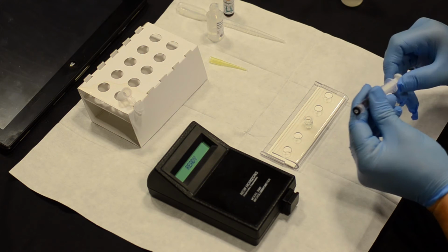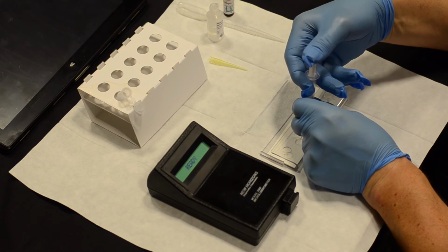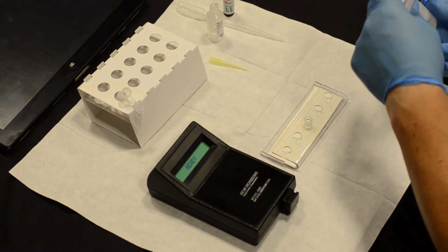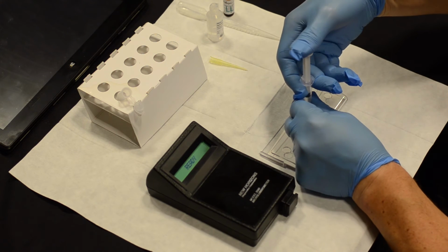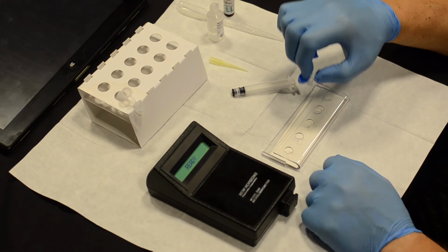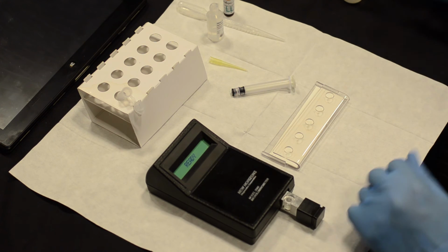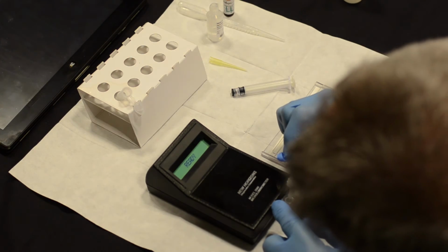I then take my special syringe, which works as a pressure syringe, and push the fluid through the filter. I then repeat that step, 3 drops, 1, 2, 3 of SRA1, and again pressurise through the filter and into the blotting paper below. Now what I've got in there is only bacterial ATP. What I need to do now is release the ATP from those bacterial cells using the bacterial releasing agent. And I use 2 drops, 1, 2, into the drawer.